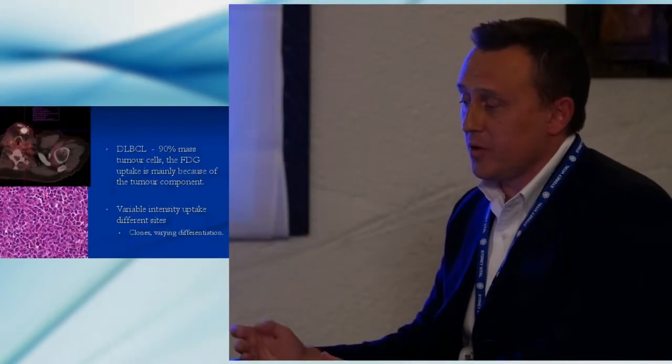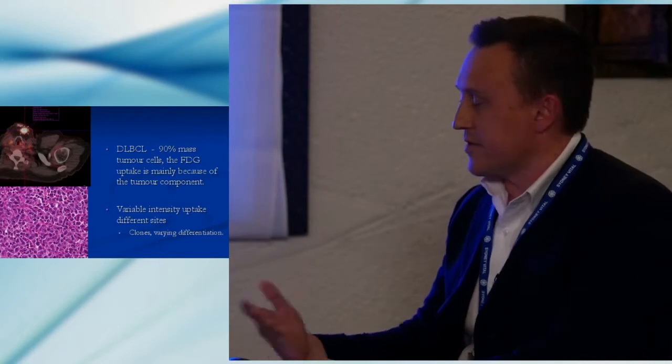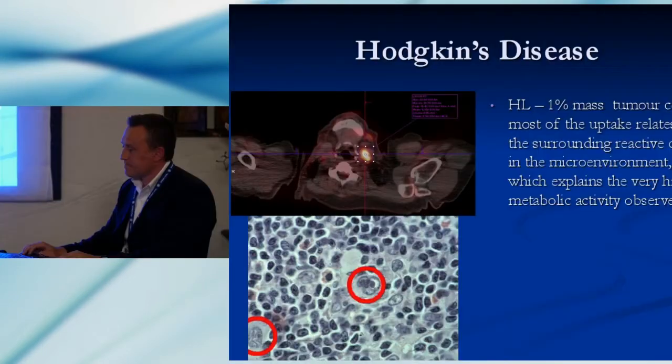And we sometimes see variable intensity uptake at different sites of disease in these patients, and it's thought related to the different clones showing different degrees of differentiation.